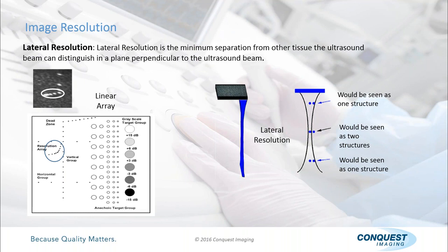Now, it's also important that you understand the importance of frequency when we're talking resolution. There's an important concept in ultrasound that the higher the frequency of the probe that we're using, the higher the resolution.